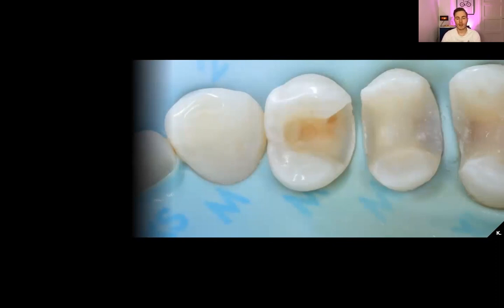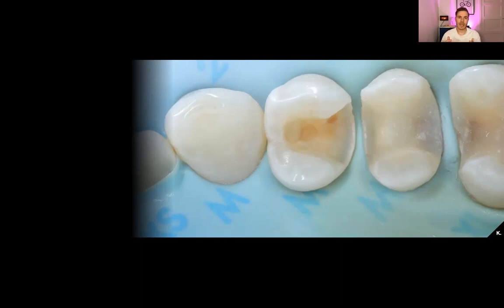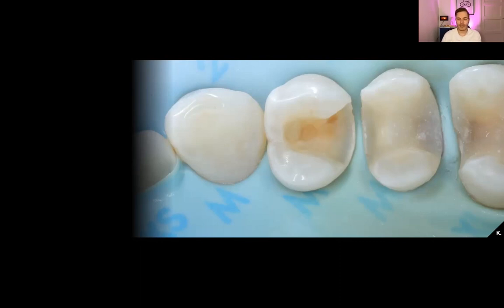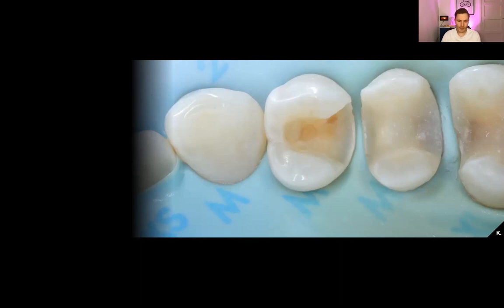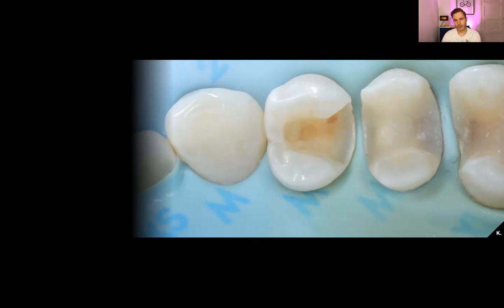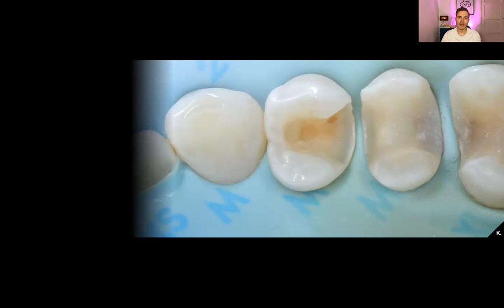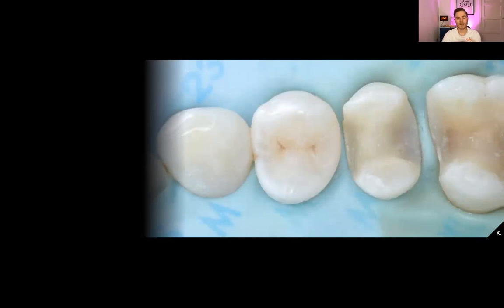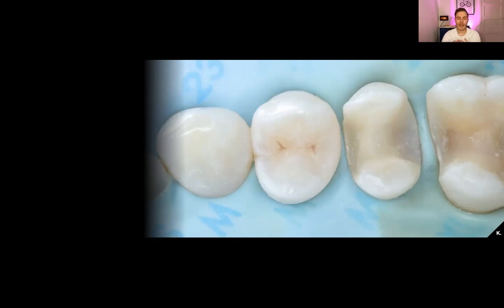The first premolar had a failing composite restoration with some secondary decay and I decided to do a direct restoration on this one. I used the same matrix-in-matrix technique to restore the entire surface. Since I didn't need to do any deep margin elevation, I used both bands to give me a really nice contour of the tooth. I used the AquaCare, the OptiBond FL, the Majesty Flow, and then Shofu Beautifil 2 LS in the A2 color — a really nice composite — to restore the entire surface. Then I used a little bit of brown tint by Kerr to give some characterization to the fissures. This is what it looks like after the direct restoration — I only need to polish it.